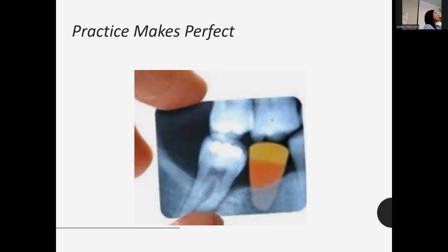I think the doctor is going to expect, and Professor Sarmiento will go over this in a little more detail, for you to at least put down the areas that you see that are raising a red flag. You're not doing the diagnosis, and they certainly know that that's not even close to where you're at, but they do expect you to write down everything. And they want you to not only look at the radiographs, but they want you to also look inside the mouth.